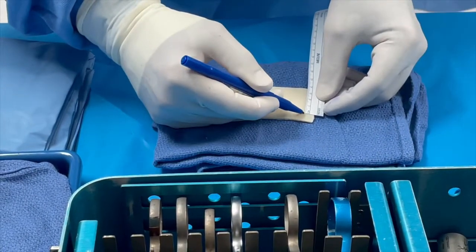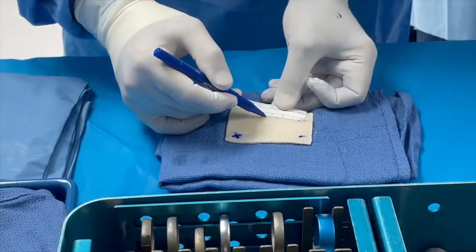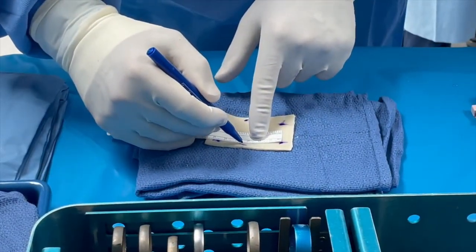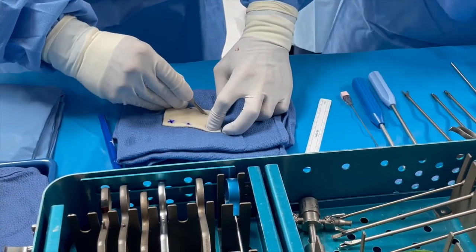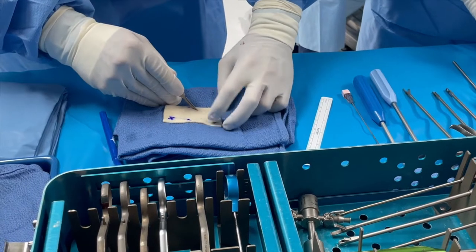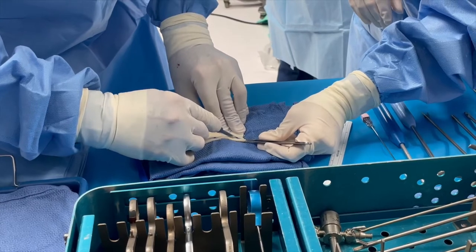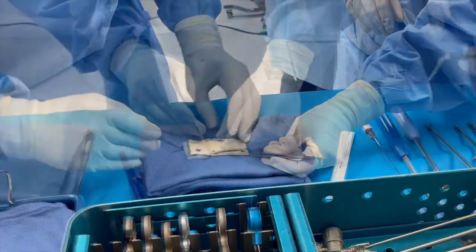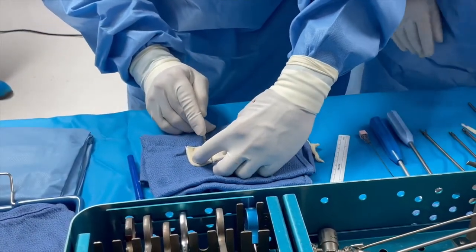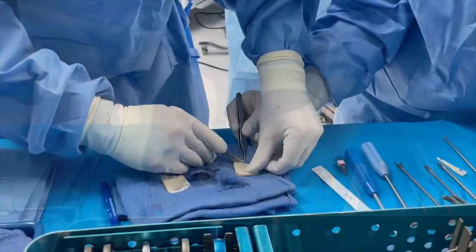We will now take the dermal allograft, which is a special graft in particular for this surgery. This is actually taken from the lumbar area in a human donor. We can either measure the graft intra-articularly, but because of the size of the patient and prior experience, we have a set dimension that we will mark out on the graft and now cut it. This is cut on a back table on top of multiple towels because the graft is quite thick.